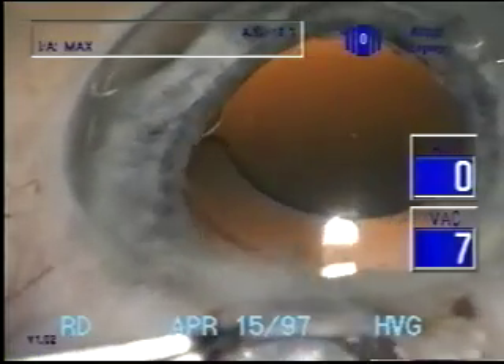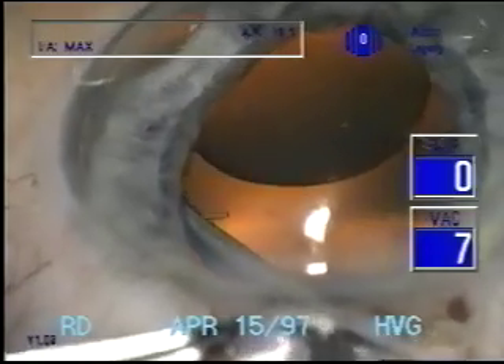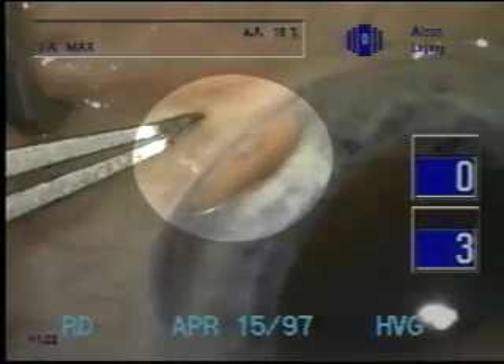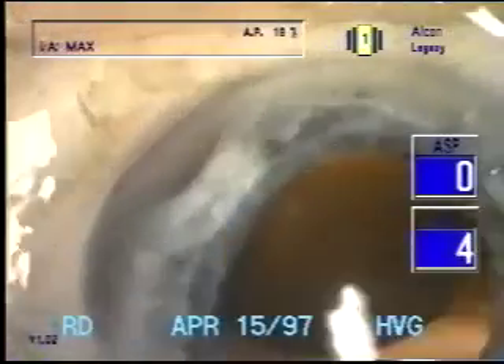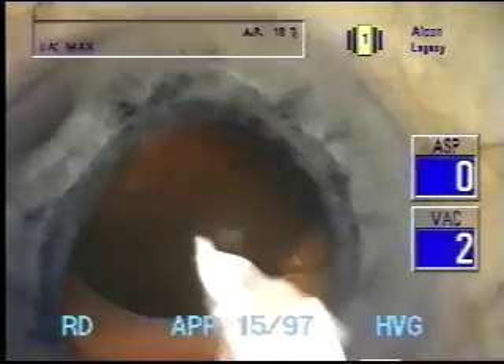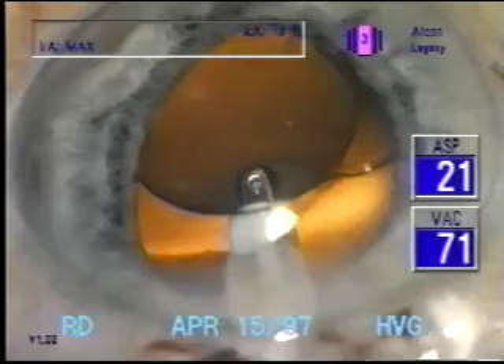With the ring in place and viscoelastic in the capsular bag, the lens is placed. One can see through the iridodialysis not only the loop of the intraocular lens but also the ends of the endocapsular tension ring overlapping each other, appearing as one loop when the bag is expanded with viscoelastic.